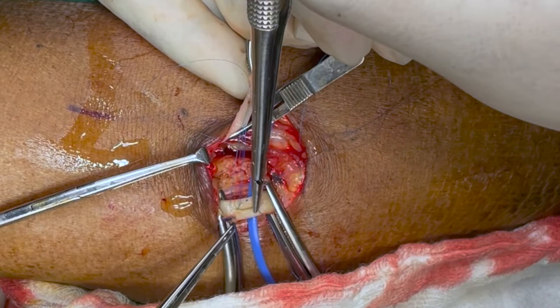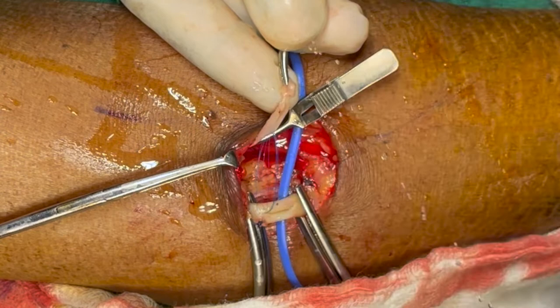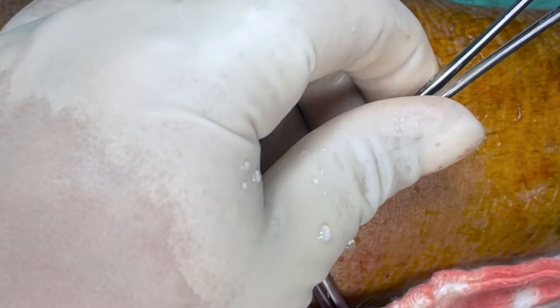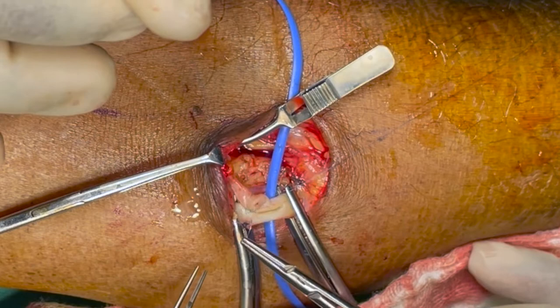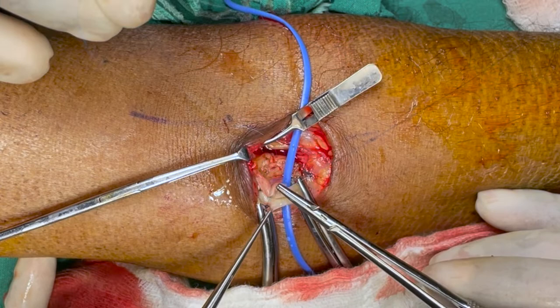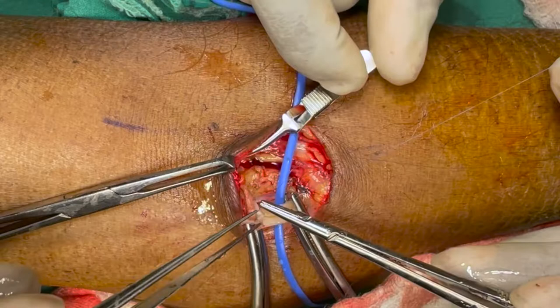Now the vein is ready to be parachuted down. With the aid of the assistant, gently lower the vein down. Once we place the vein, we prefer to take one or two bites from the near side. Then we move on to the far side of the anastomosis and continue in a backhand fashion.